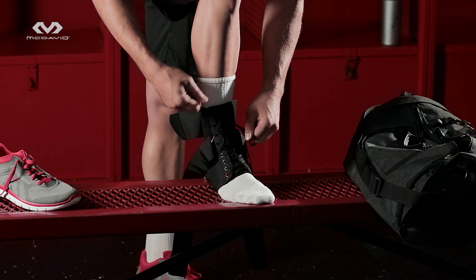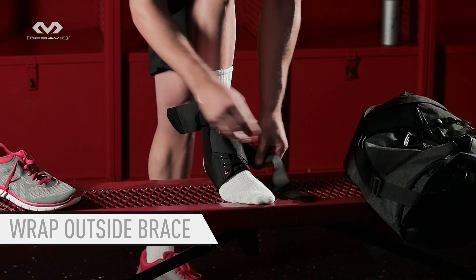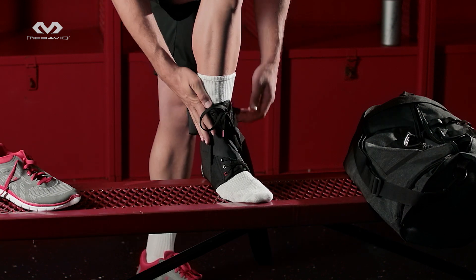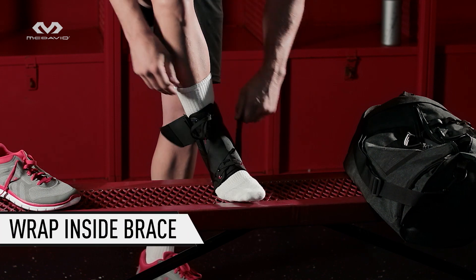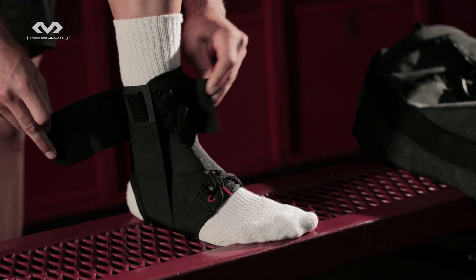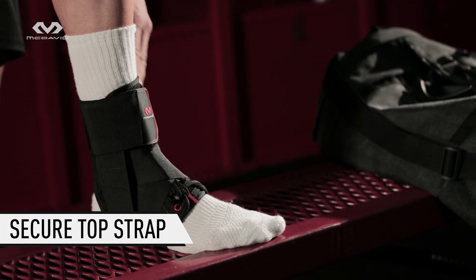Grasp the strap on the outside of the brace, extend up, wrap over the top of the foot, under the arch, and back to the outside of the foot, securing vertically up the side of the ankle. Repeat with the inside strap. Now wrap the top horizontal strap around the ankle with the logo facing forward.